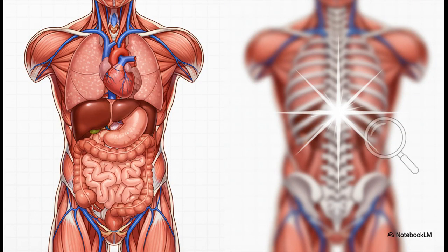But there's a huge problem. This simple smearing technique creates a blurry, out-of-focus mess. You get these classic star-like artifacts all over the place. The smearing process itself just fundamentally blurs everything. So yeah, it's a start, but it's absolutely not the sharp, clear image a doctor needs to make a diagnosis.